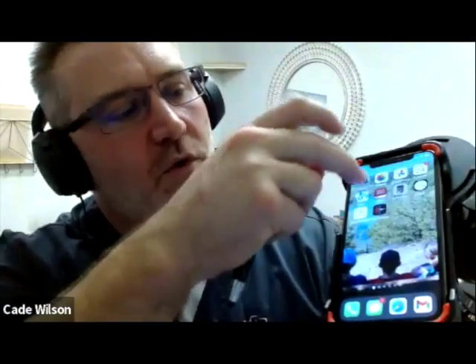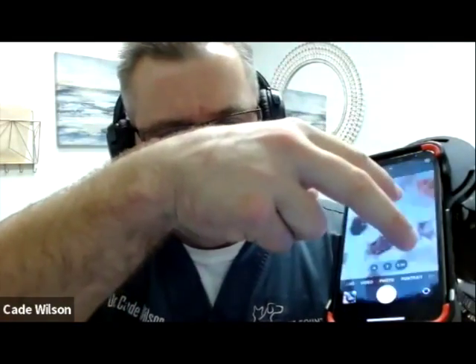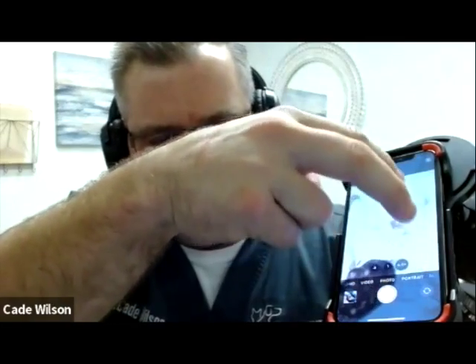But what I do in my practice, I almost always use video. And I don't know that I can show this. Let's just see here. So when you're taking a picture, this is just my normal iPhone. When you try to do your digital zoom, most phones at about 2 kick off or start freaking out. Of course, it's not going to do it on this one, but you can see, let's go back to 1.